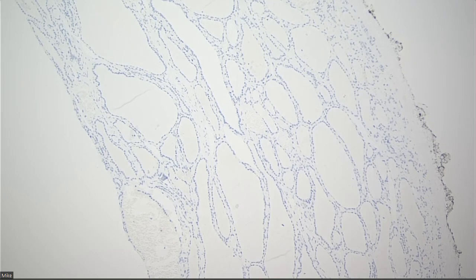So now it's a little bit dirtier of a background. So we just have to be a little bit more cautious in interpreting a BRAF, but usually the tumors tend to be really strong and the background has a little bit of wishy-washiness. Okay, so that's my comment on the immunostain. However, we can regard this as BRAF V600E positive.